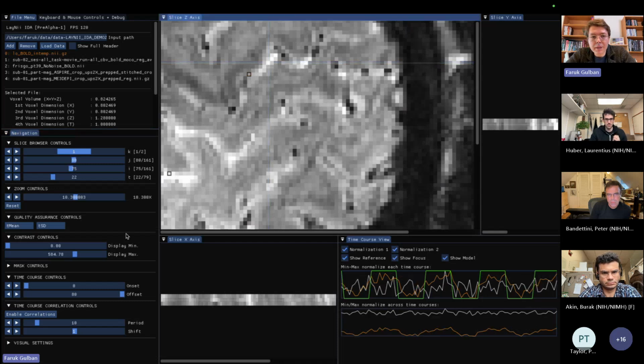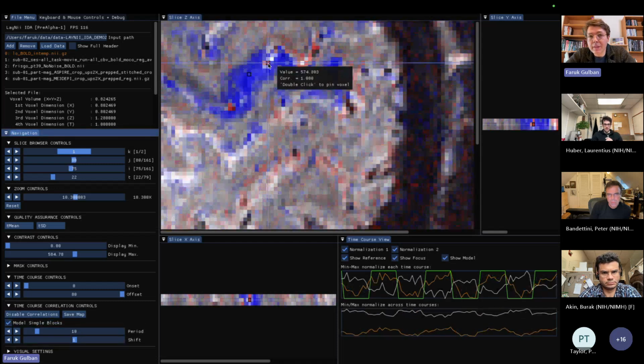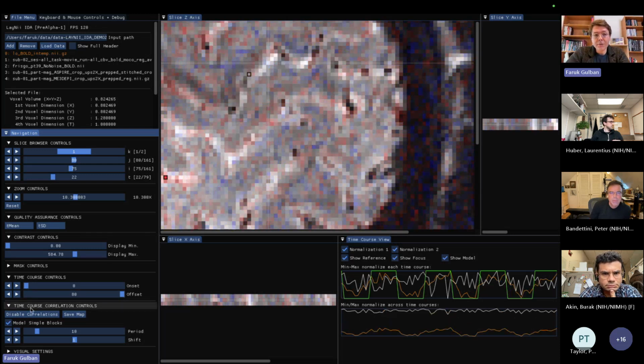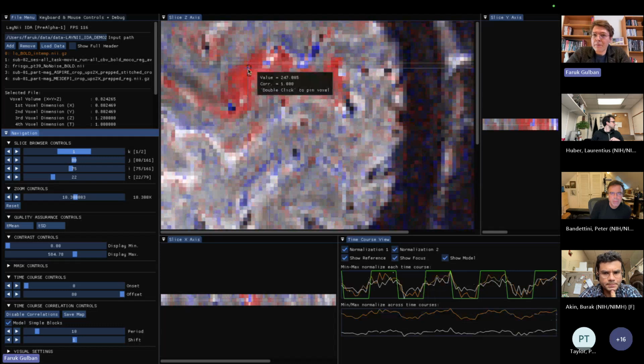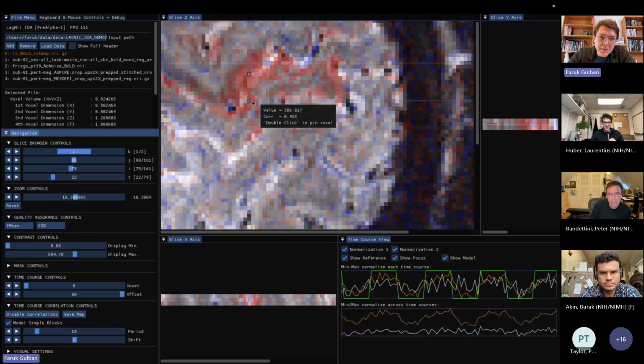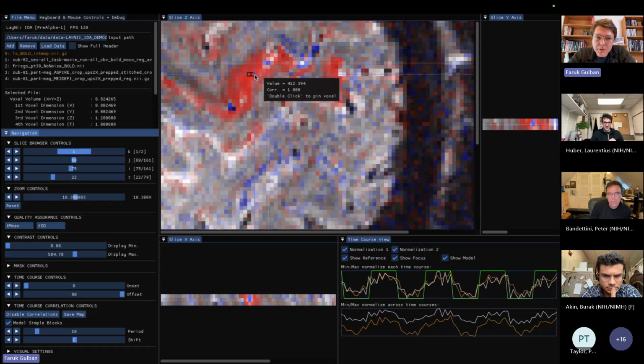There is something else going on, and I suspect that there's actually an artery inside there, and when there's activity and enough blood motion artifact in it, it dilates a bit, and it creates this negatively correlated activity in there. I hope I make some sense. And we can discuss in the following minutes.